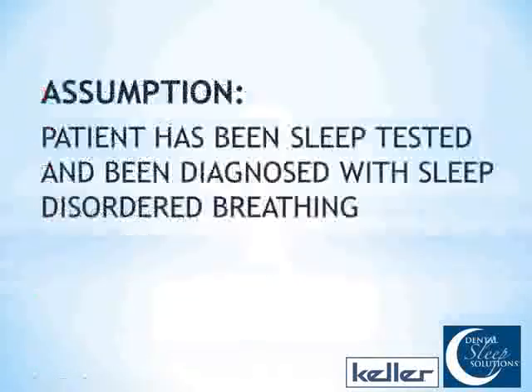First of all, we're going to make an assumption that patients have been sleep tested and been diagnosed with sleep disordered breathing, or maybe I should say been at least ruled out of having sleep disordered breathing or obstructive sleep apnea. The days of just making mandibular advancement devices for patients just because they snore, without having some sort of sleep test, I hope are over, because the majority of these people have at least sleep disordered breathing, and we do need to do some sort of sleep test, whether it's a polysomnograph or home sleep test, prior.